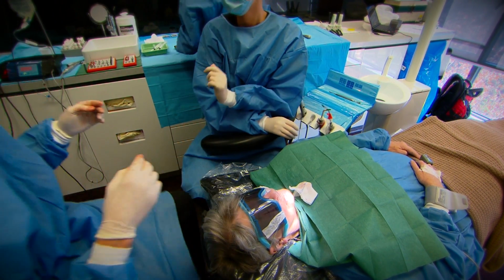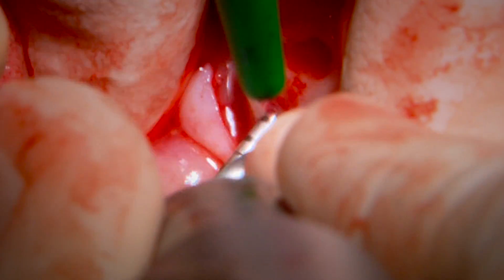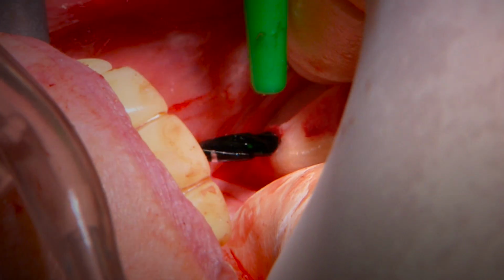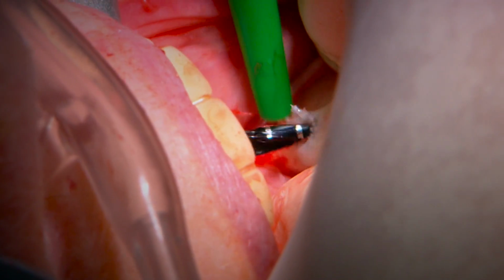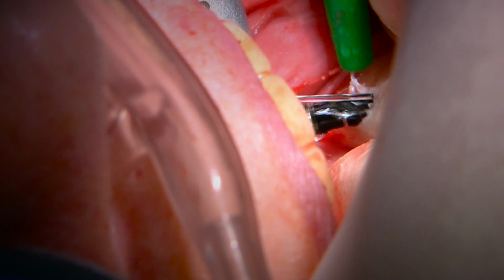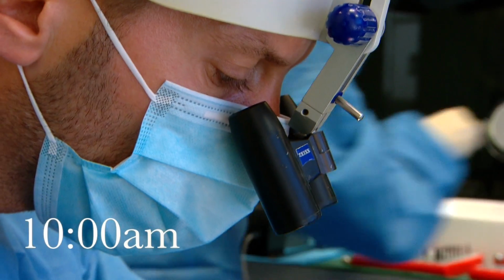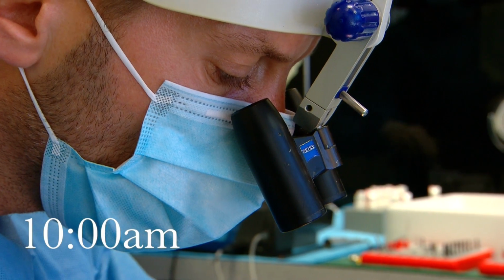We use a pilot drill. It's just like putting a screw into a hard piece of wood. We've got the back ones, remember, at that 40-degree, 45-degree angle. We're going 15 mils there. We know the length we're going to, and we just use successively wider and wider drills until we're happy with the width of the hole, then we tap our implant in.